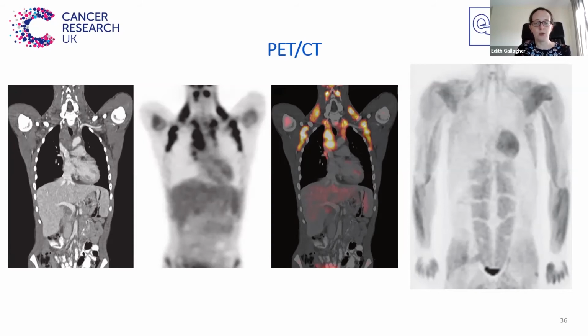If a patient is cold after injecting, there may be uptake in the brown fat of the patient, as can be seen in the set of images on the left-hand side. And if a patient has had a particularly strenuous session at the gym the day before, then there may be quite a bit of muscle uptake, as can be seen on the image on the right.